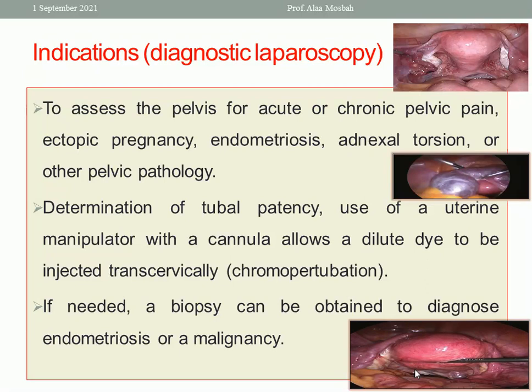Also, we can detect the hydrosalpinx. The hydrosalpinx, the tube will be dilated and bluish in color, and also there is variation in its dilatation and its size.